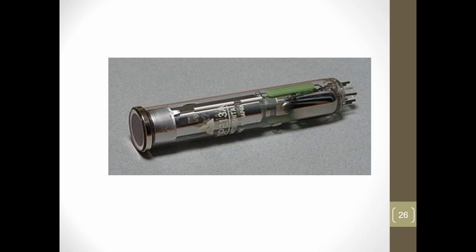It's the early digital versions. This one was far superior. The only bad part about these is they were really bad at consuming power, and you had to let them warm up. So if you had an emergency, or there was a rush, the image quality was very poor. It took about 15 minutes for these guys to actually warm up and get where they needed to go. But by far, once these guys were calibrated and working, they really gave a nice image.